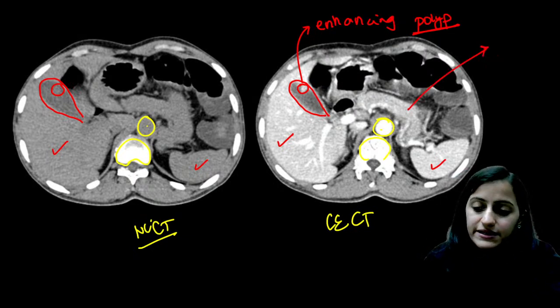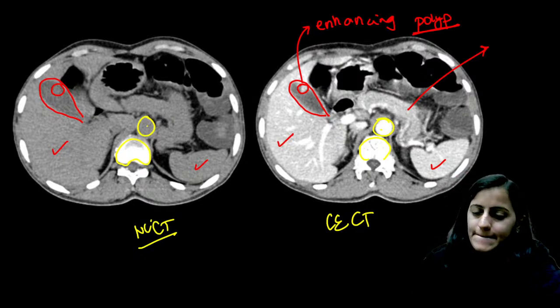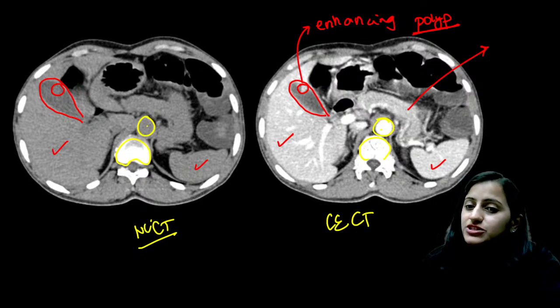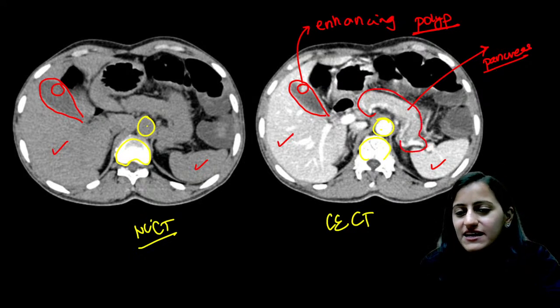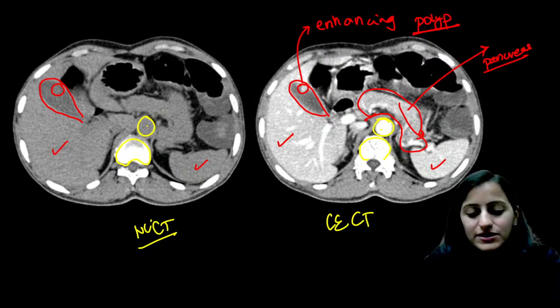Tell me, what is this here? What is this structure here anatomically? What is that structure there? It is pancreas. Absolutely right, Ian. This is pancreas. Okay. So going from the right side towards the left side, towards the spleen it is going. That is pancreas.